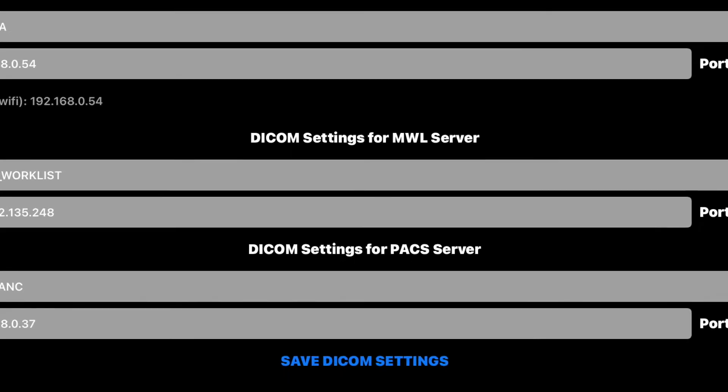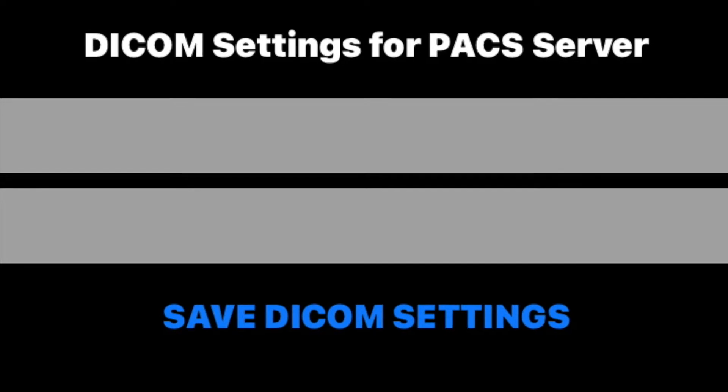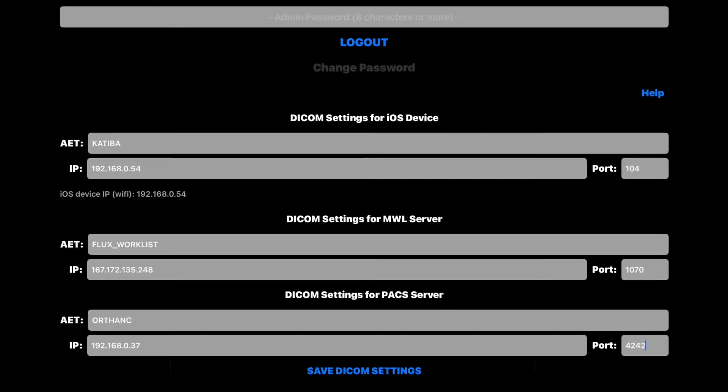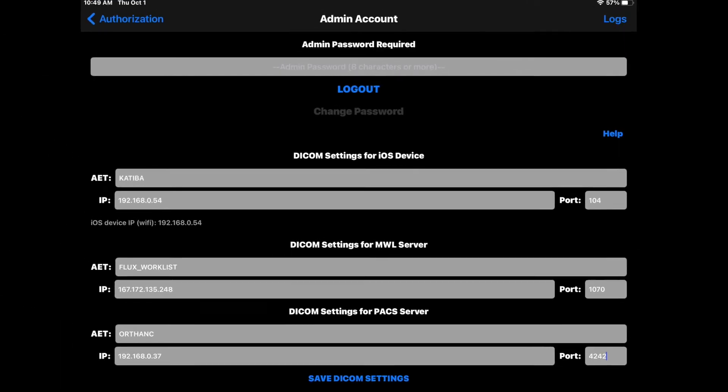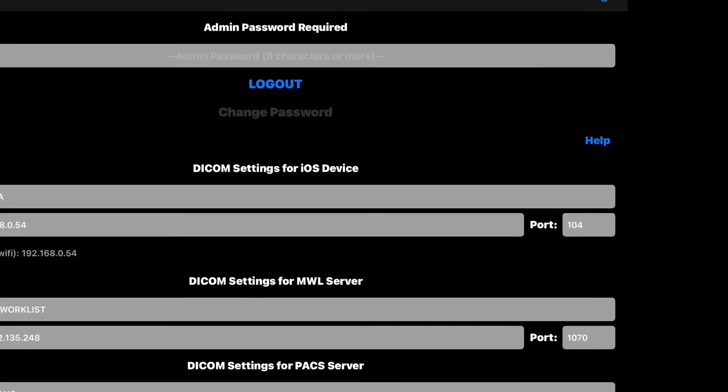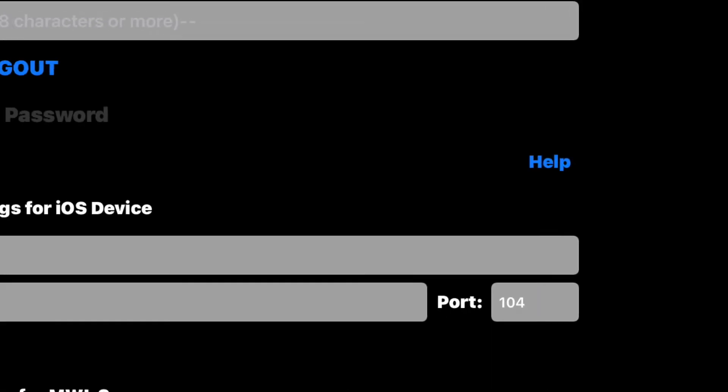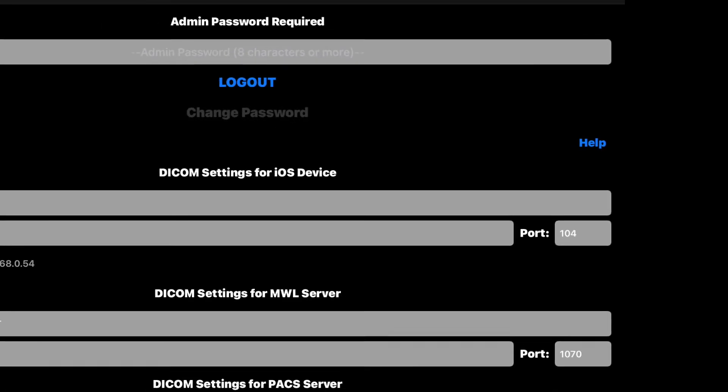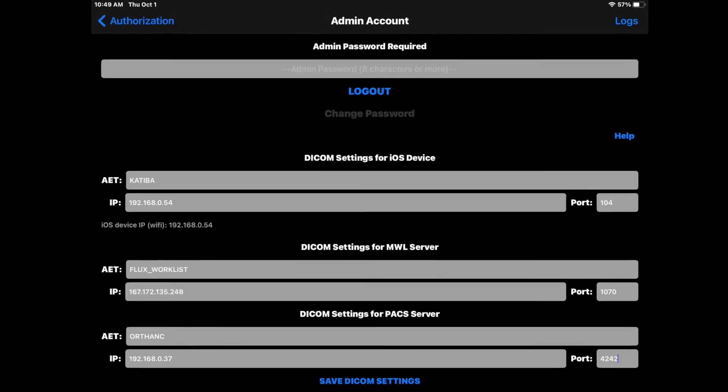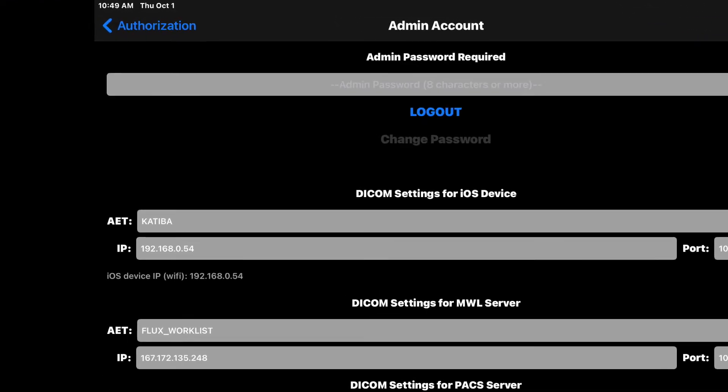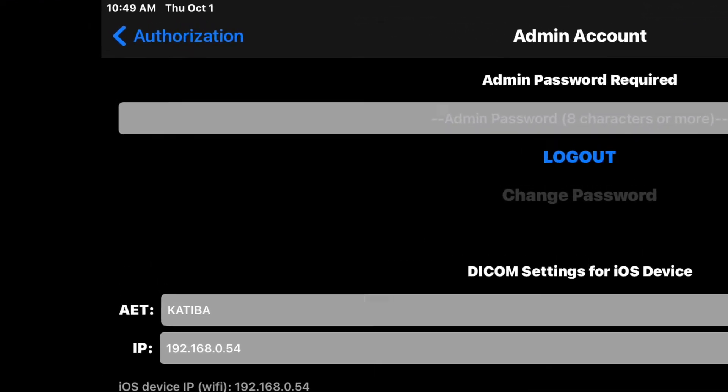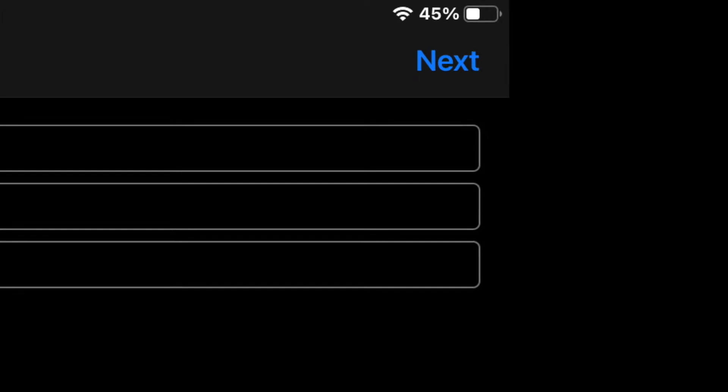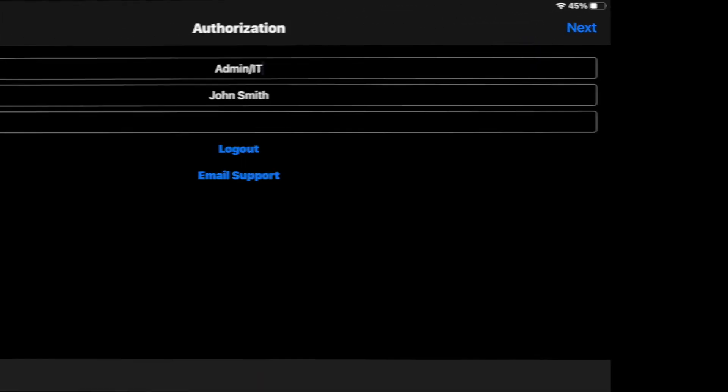Tap Save DICOM Settings to save the settings on your device. If you need help, tap on the Help button to contact us by email. We will respond to you as soon as we can. Tap Authorization to go back to the login page. Tap Next to go to Table of Contents.